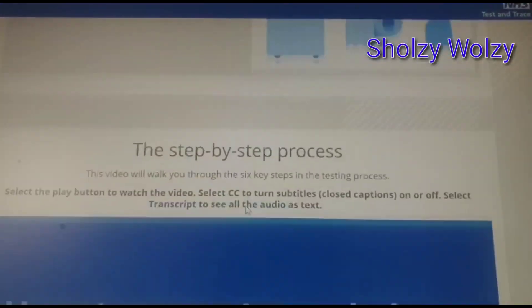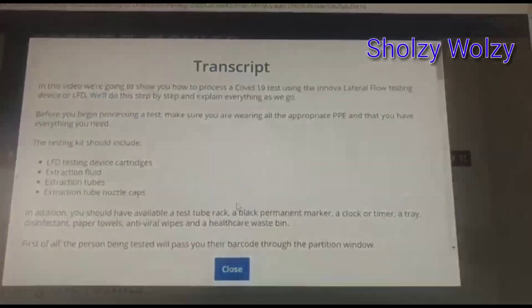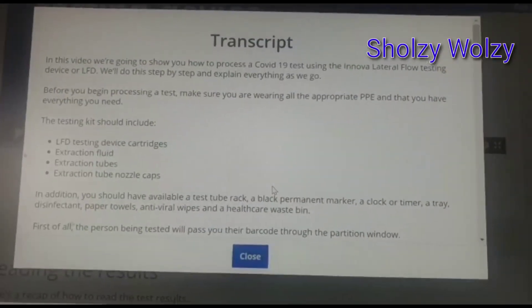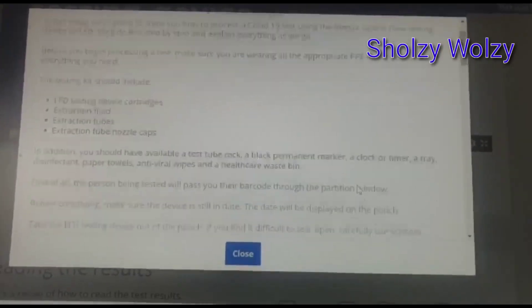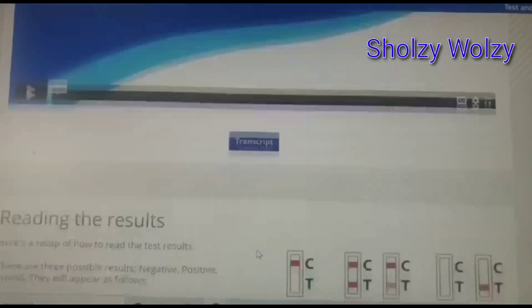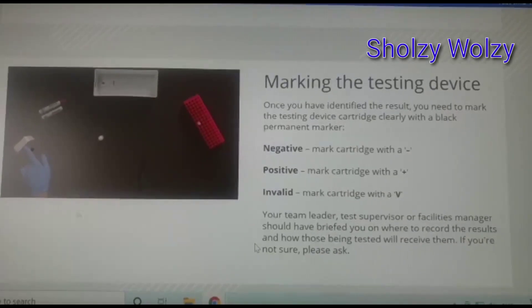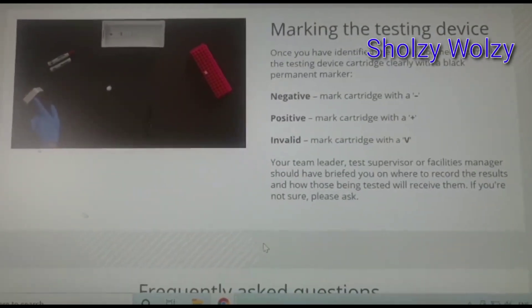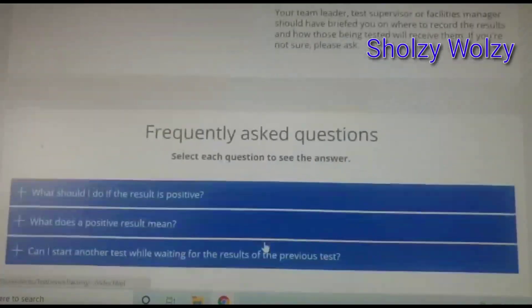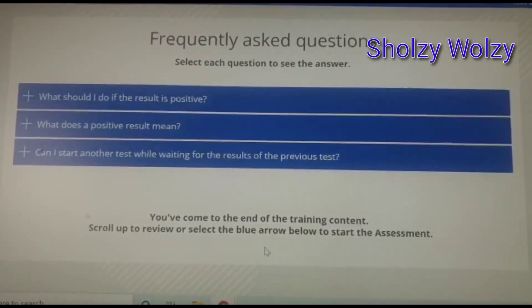So now I'm just going to click on this — this is the transcript. After that I can close it and scroll down again, and it brings me here. This is where the testing results are shown: negative, positive, invalid, or other invalid. And then there are frequently asked questions.